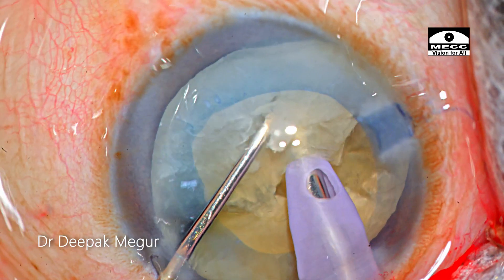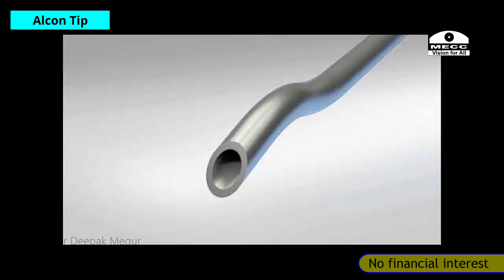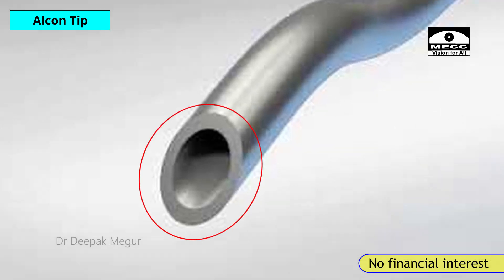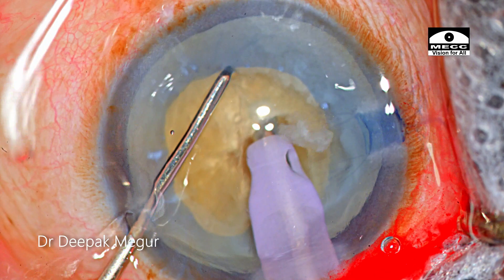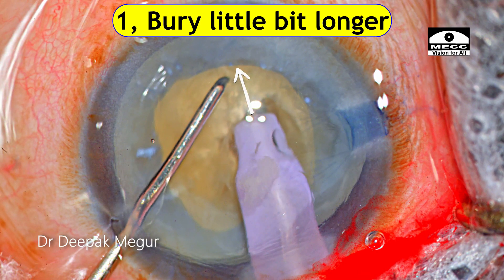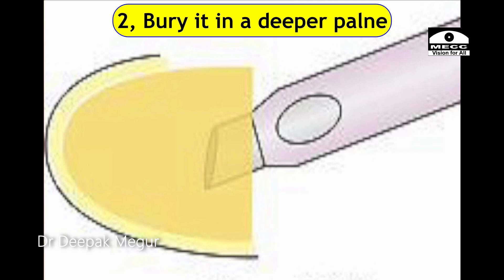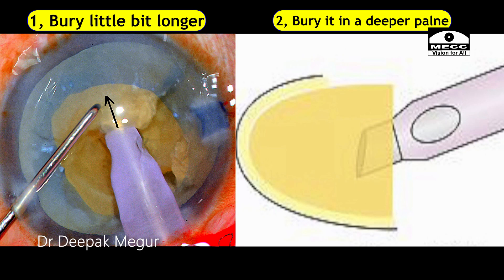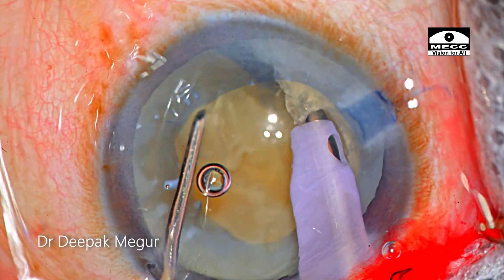Whatever tip you're using, ensure that the grip is firm. The Alcon tips are extremely thin and the surface area is very small, unlike the bulbous and flared tips of some other companies. There are two important things: we need to bury a little bit longer especially in a denser nucleus, and we need to bury it in a deeper plane. These two points ensure a very firm grip and consequently the chopping becomes quite easy.